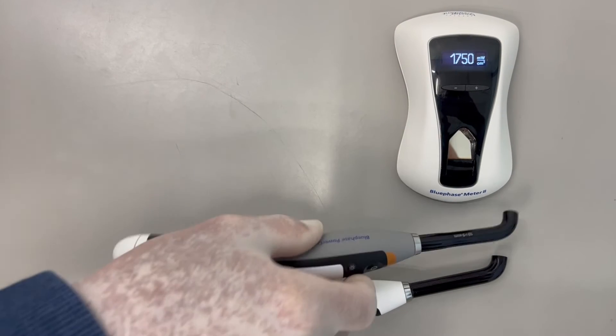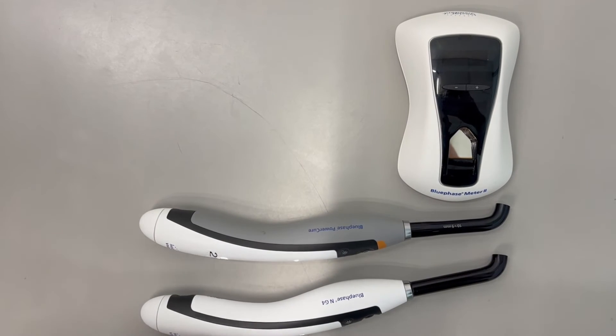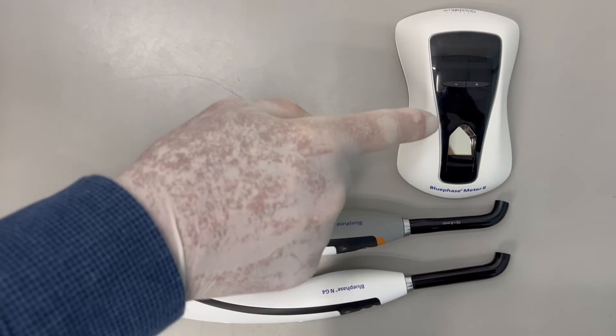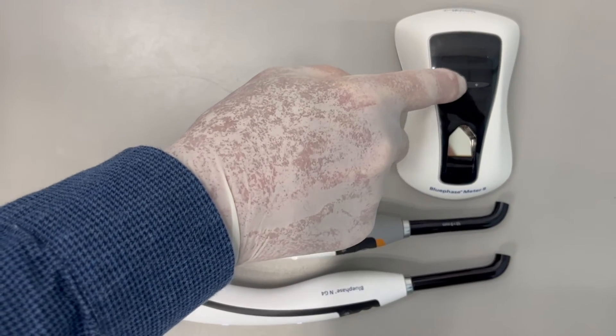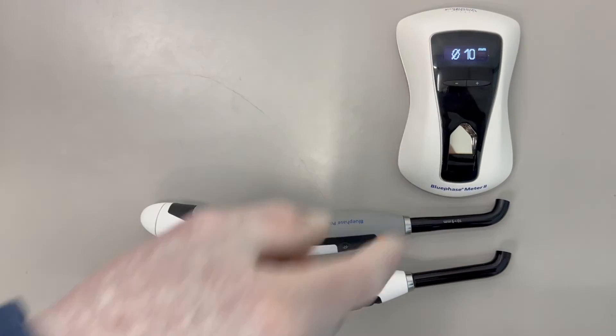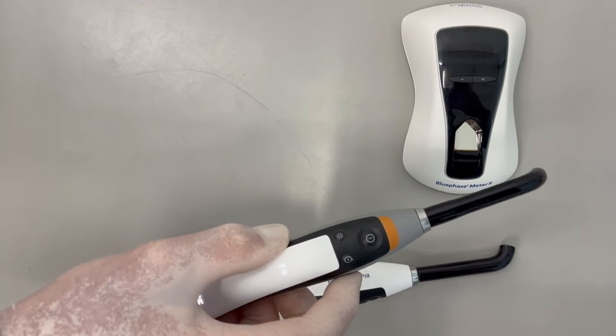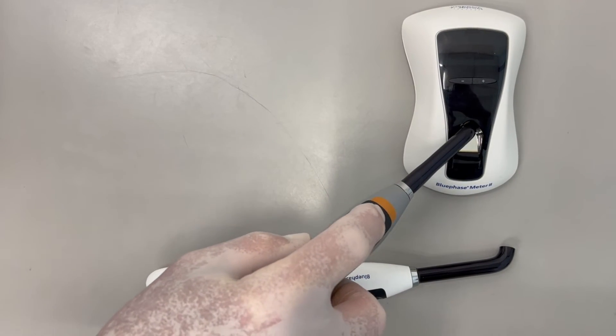On both high and turbo settings, these two lights deliver the same output. If we measure the PowerCure using a tip diameter of 10mm, the irradiance falls to 1430. However, because we entered the wrong tip diameter, that is not the correct irradiance.